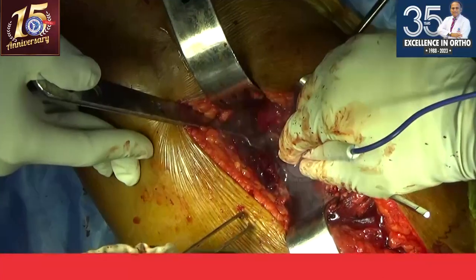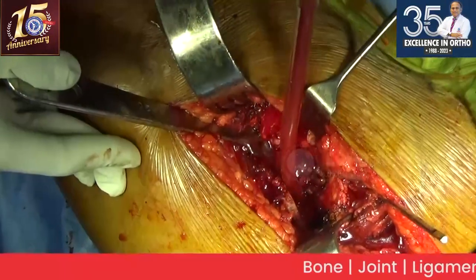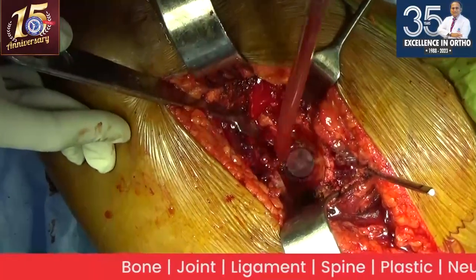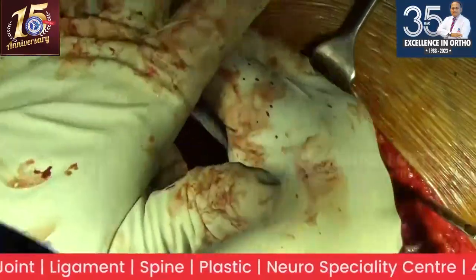When you are doing an anterolateral approach, better not to put any Langenbach back on the anterior side. You release the structures on the anterior side and put a Hohmann, which is close to the bone, because putting a Langenbach can cause a femoral palsy.